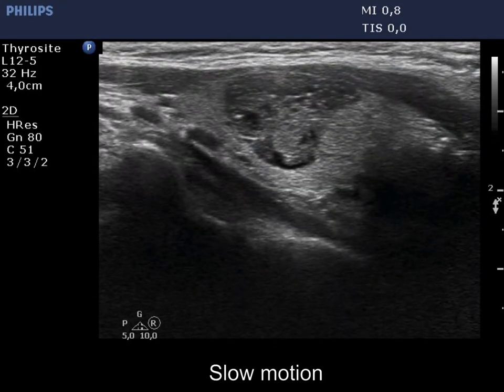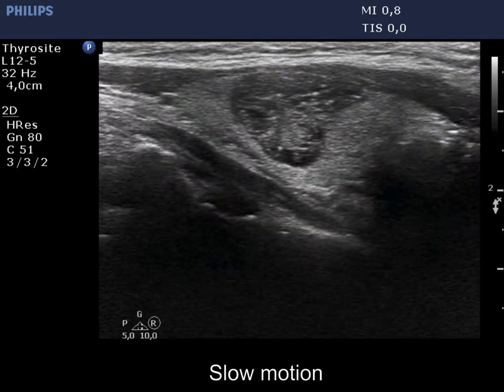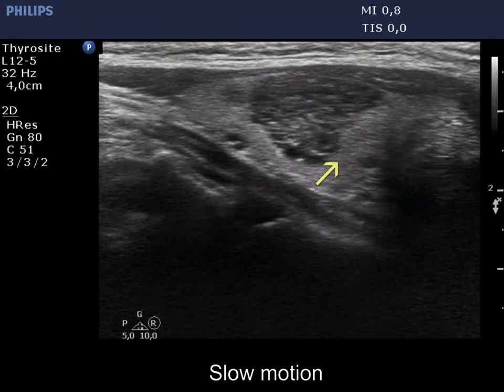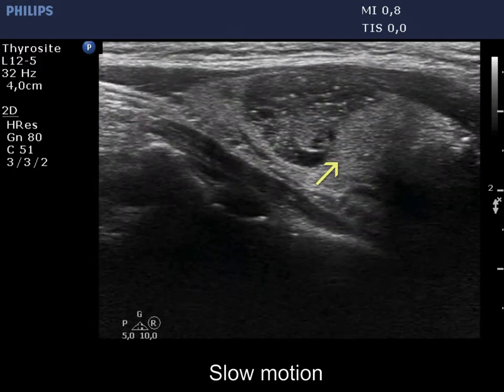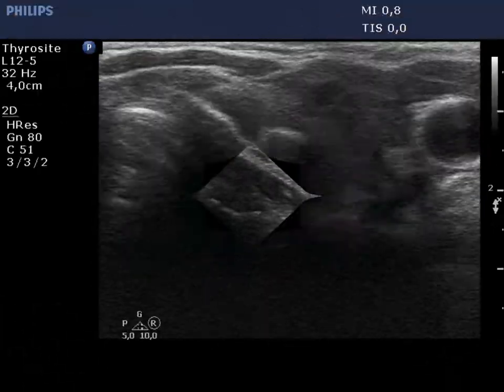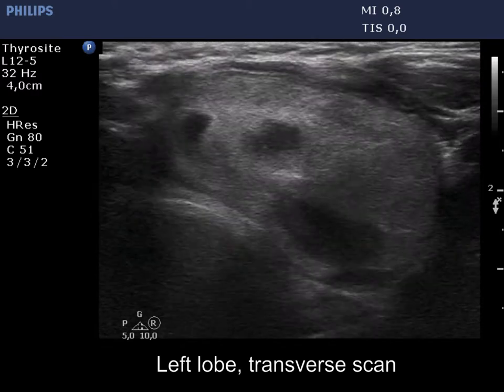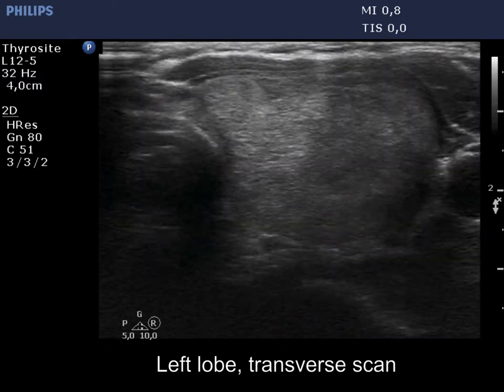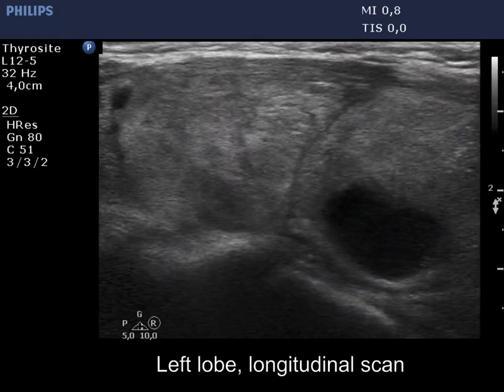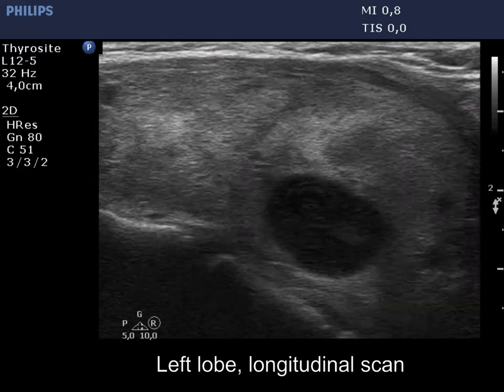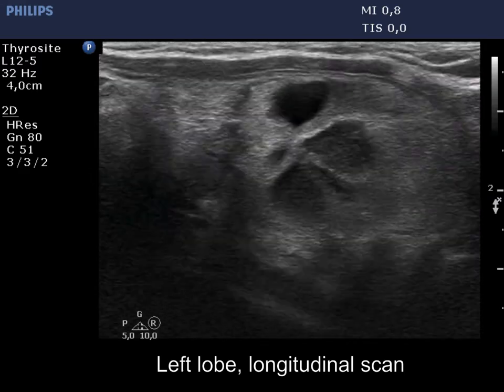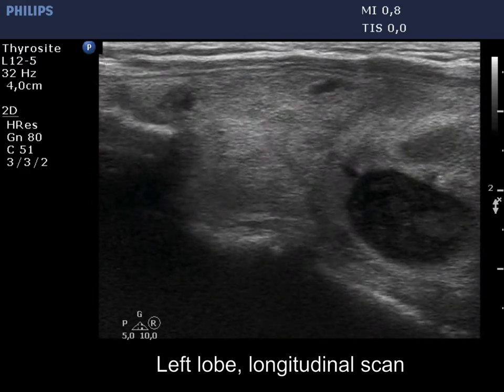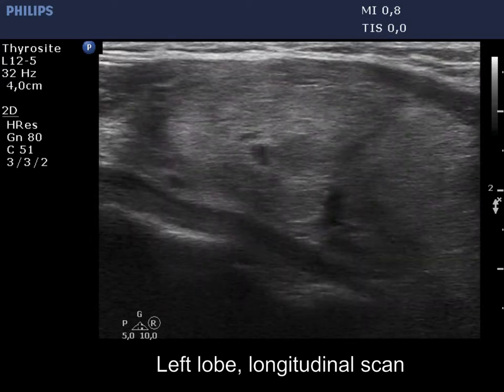Second, there is an undulation on the medial border of the lesion which was caused by the presence of a neighboring echonormal lesion. The left lobe was composed of a large nodular area. The borders between the nodules, or between the two parts of the nodule, are lobulated. This is again not a pathological form of irregular margins.